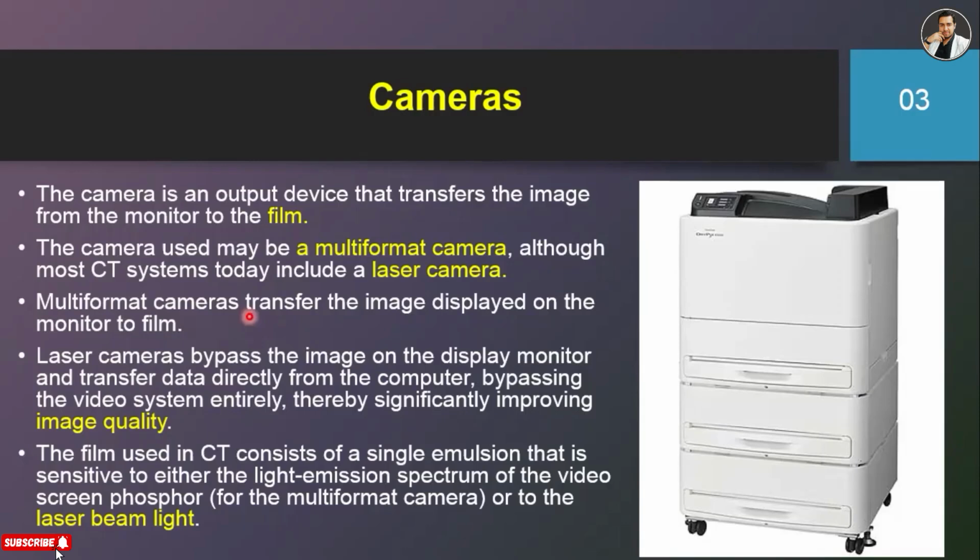When we select a printer, we have to select a camera. You have to select a camera or printer to print the films.